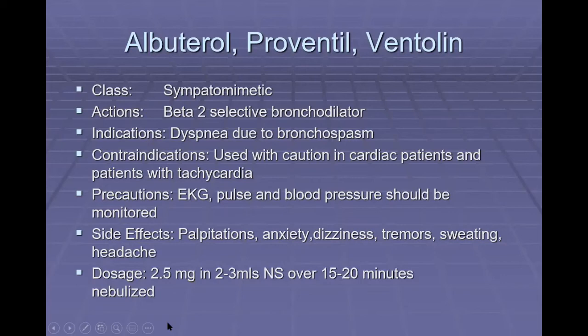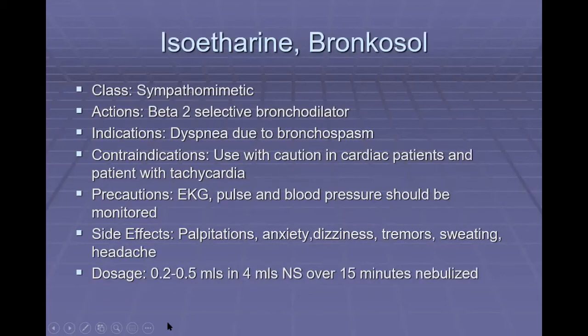The dosage is 2.5 milligrams and 2 to 3 milliliters of normal saline over 15 to 20 minutes nebulized. All right, this is a nebulized treatment. We're going to show you how to do that in just a second.